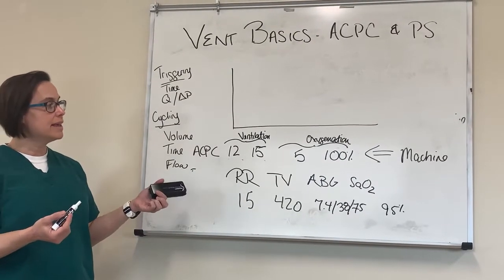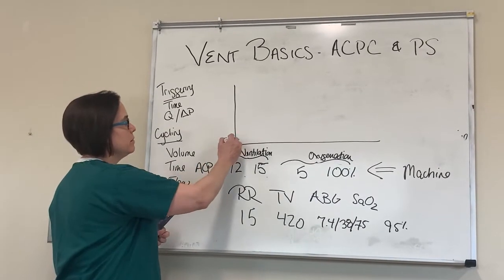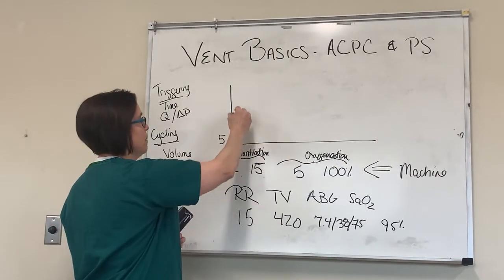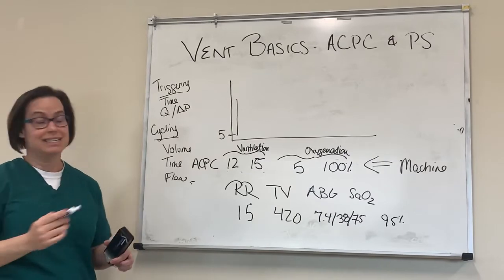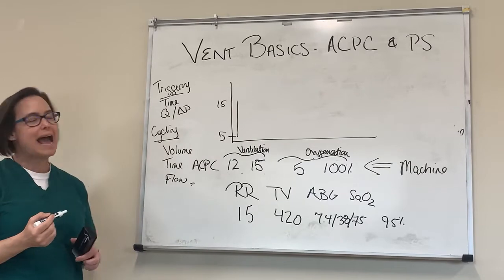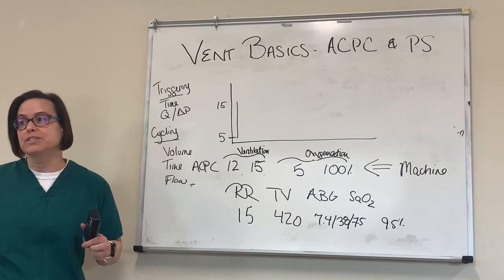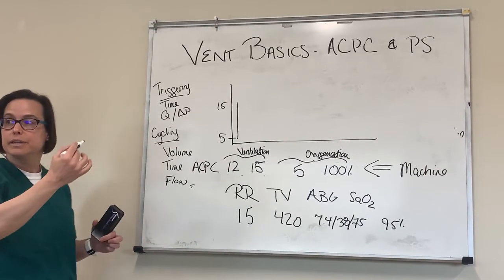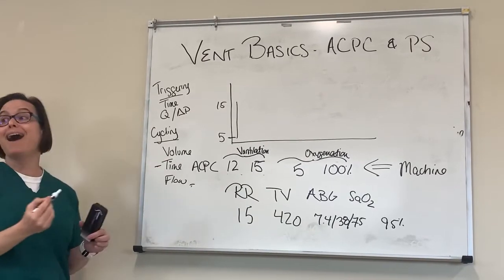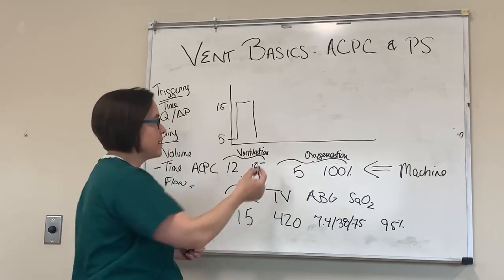So how this ends up being a little different than ACVC is, here we're gonna start at a PEEP. We're gonna go up instantaneously, essentially, to that other pressure. Here we're gonna say that pressure is 15. Then how is my breath gonna know when to shift from inspiration to expiration? Change in pressure? So it's not actually gonna be a change in pressure. This one is gonna be time cycled, okay? So I actually think that this is a little easier to work with from that perspective.